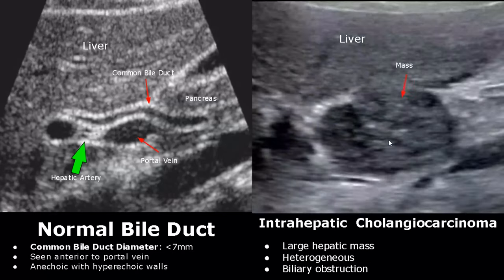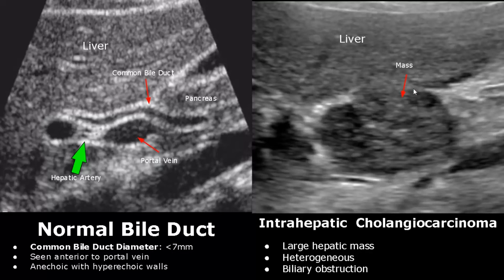Intrahepatic cholangiocarcinoma is the second type — it can also be classified under liver cancers. There is a large heterogeneous mass involving both the bile duct and the liver.